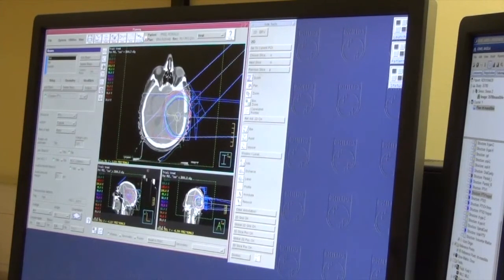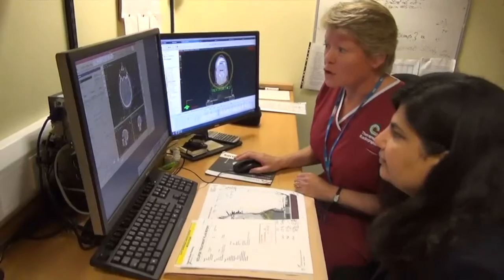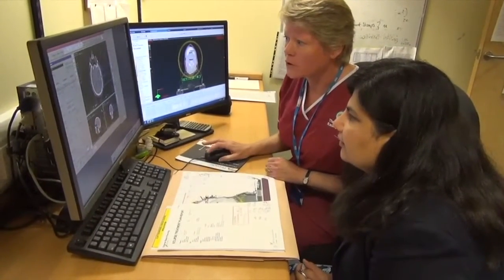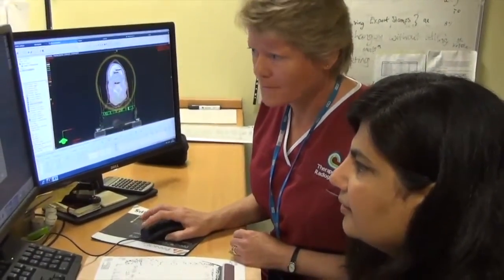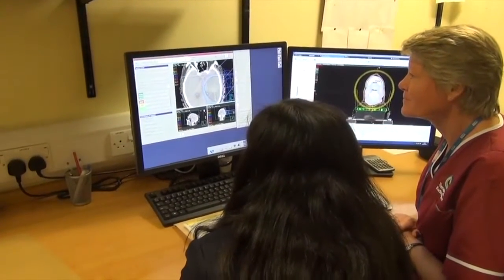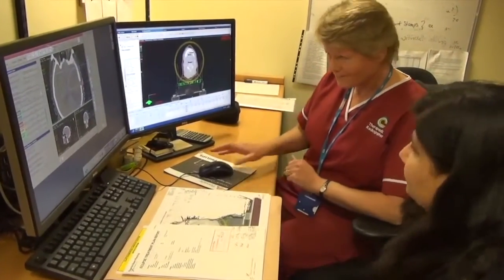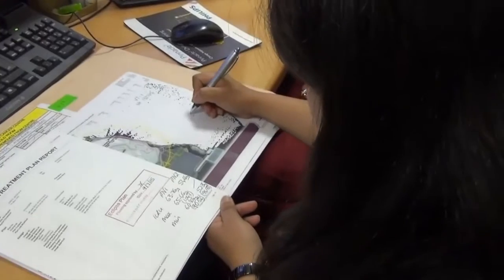All organs at risk are outlined and the beams are placed on the plan. During the planning process the consultant's input is often required, as it involves balancing dose to one organ against another. The consultant is called to review the plan on screen, often choosing between two different plans, and selects the one they consider optimal for the patient. Once completed, the plan is approved by the clinical oncologist and the completed plans are sent to the treatment machine.